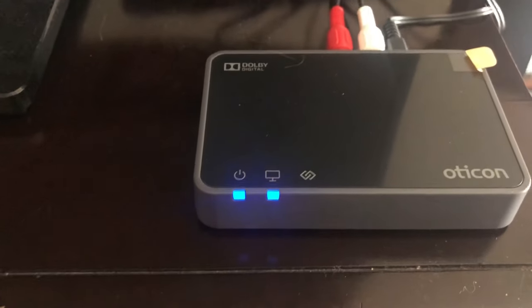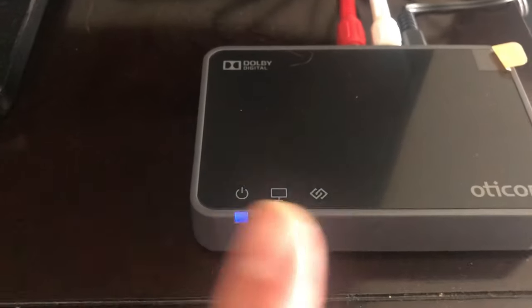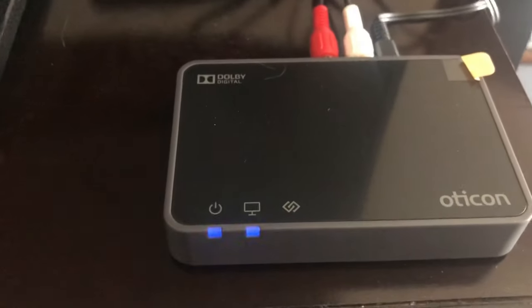As shown in the user guide, two blue lights mean the box is not connected to the hearing aid yet. Knowing what these lights mean will save you a world of headache.